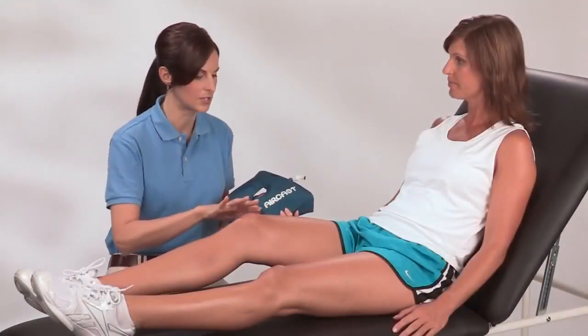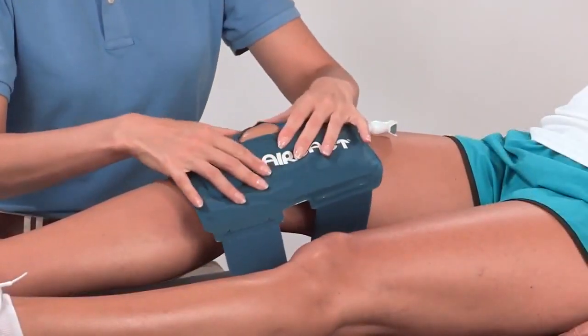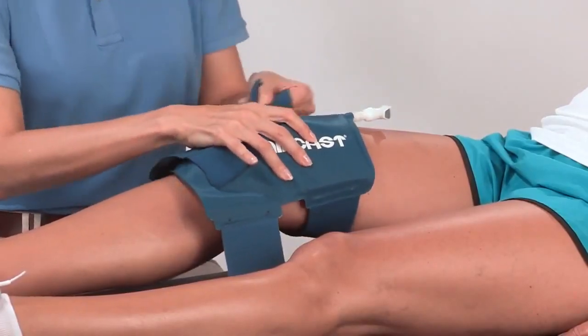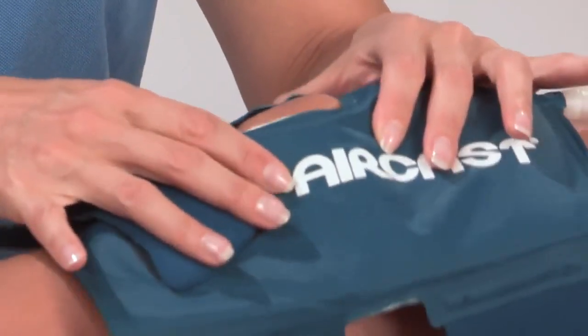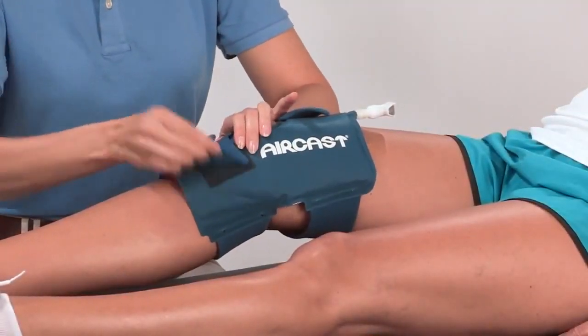Remember, only apply the knee cryo-cuff when it is empty. Lay the cuff on the front of your knee and secure the top strap so it's snug but not tight. Adjust the front opening so the cuff conforms to your slightly flexed knee — your kneecap should appear through the opening. Secure the bottom strap loosely; don't stretch the elastic.